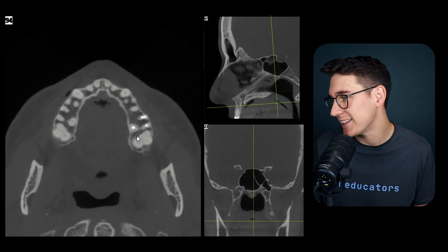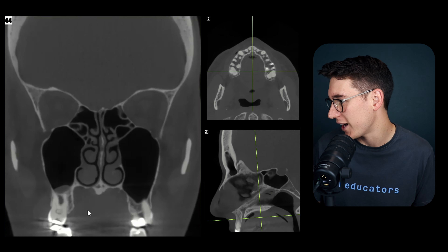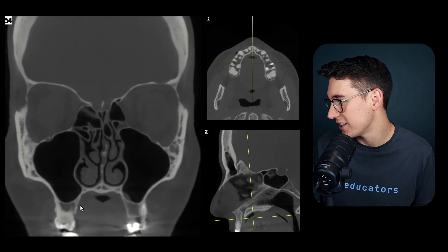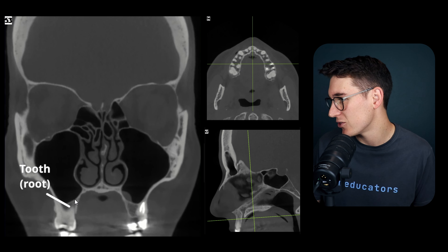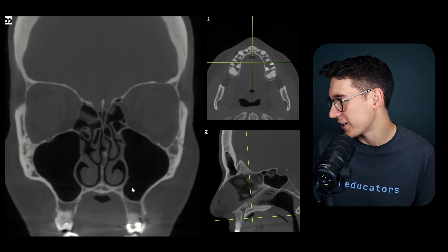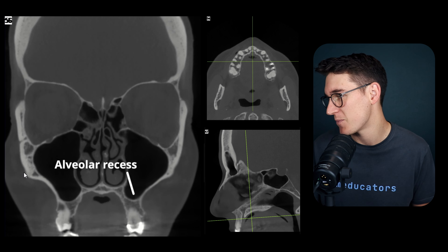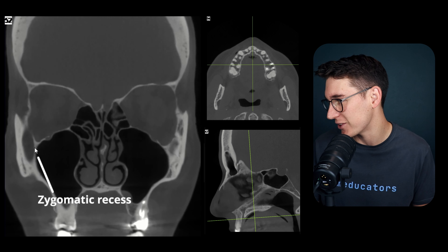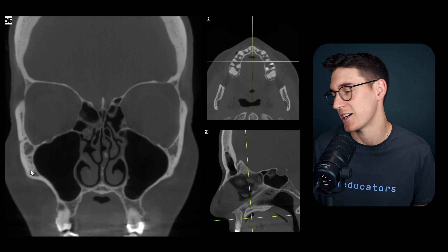On our coronal scan we can see why these are called processes - the maxilla extends down like this. Notice how the roots of the teeth come into very close contact with the maxillary sinus. The maxillary sinus also has an alveolar recess extending downward, and zygomatic recesses extending out towards the zygoma.